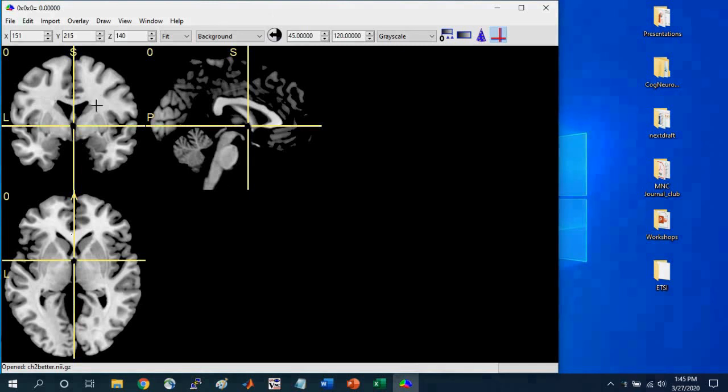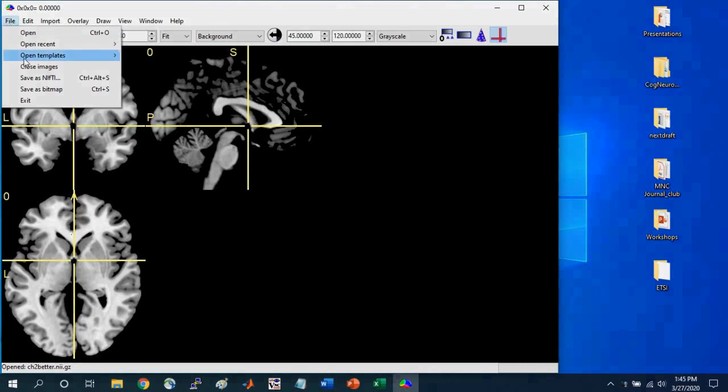And so if you want to see this specific brain file, you can go to File, Open Templates, and select the CH2 Better Brain. And this will load this particular brain.